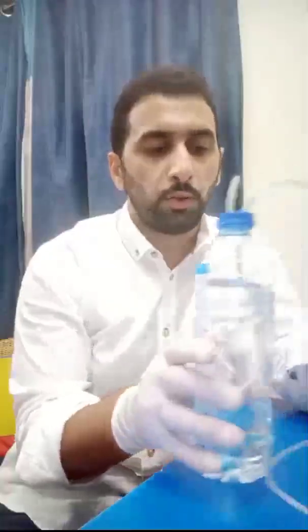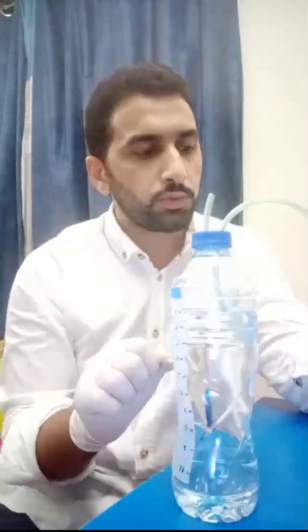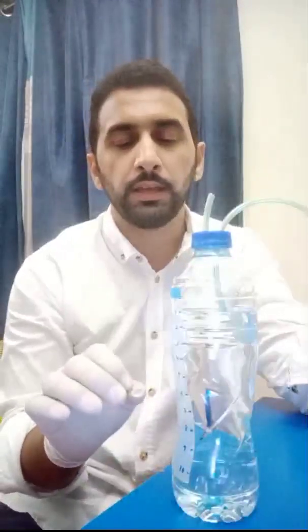To confirm that your connection is correct, you need to see bubbles in the bottle. If there are no bubbles, there is a leakage of air. The most common site of leakage is the nasal part — make sure there is a tight seal at the nose. Leakage can also occur at the internal connections you made, so ensure all connections are sealed. When you see bubbles, you can confirm the CPAP is functioning properly.